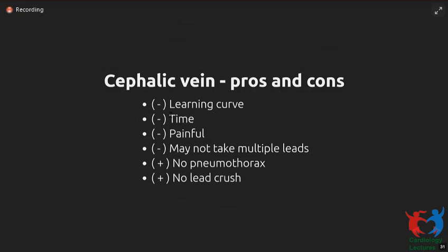So when you think of the pros and cons, I think the cons are, so usually people are worried about the learning curve. People who have not been exposed to using the cephalic vein during their training think it's a difficult procedure to do, and therefore they don't attempt it at all. So what we try to do is train everyone in getting used to this first, because once you do about 10 cases also, you get confidence.